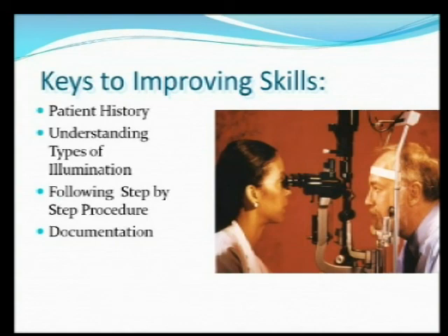Or even in the dispensing lab, maybe you use a padded plier for end pieces, you're using a nose adjusting plier, you're using a flat round. You've got certain favorite tools that you use all the time, but then there's a few tools that are nice to have for special situations. And that's kind of the way some of these illuminations are with the slit lamp.